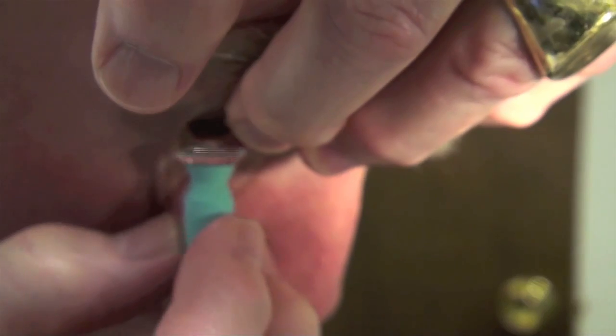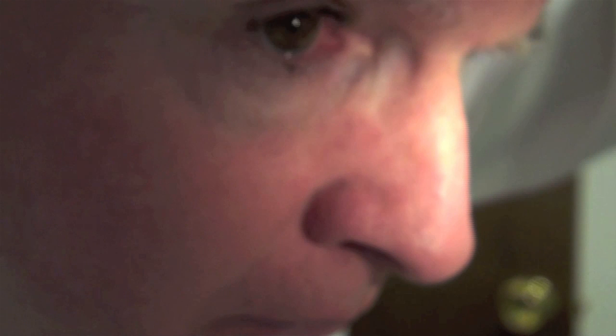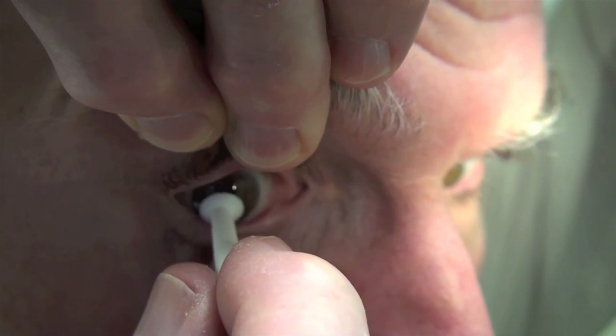I fill the lens completely with non-preserved sterile saline — fill it to the rim. Here I am putting it on my own eye. I retract the lower lid, look directly down at the floor, look directly into the lens at the center of the suction cup, apply it to the eye, and squeeze the bulb to release it. To remove the lens, I use a smaller device — and there, I took the lens off.